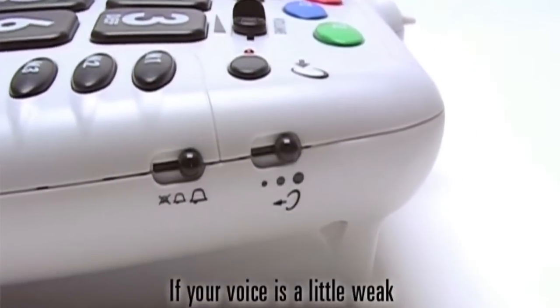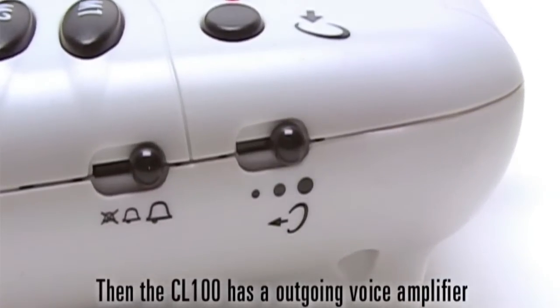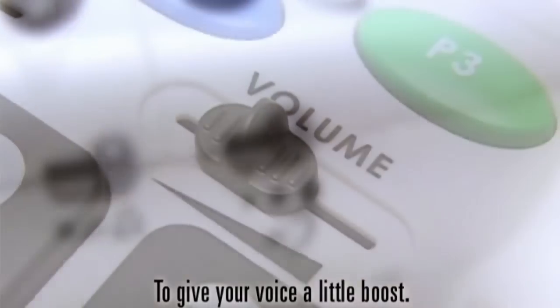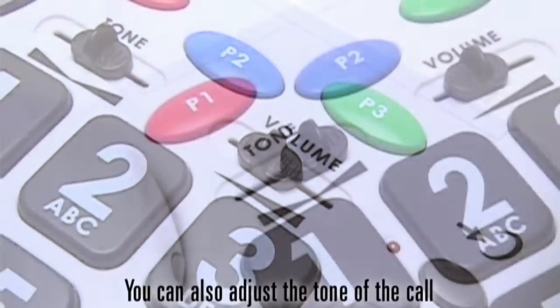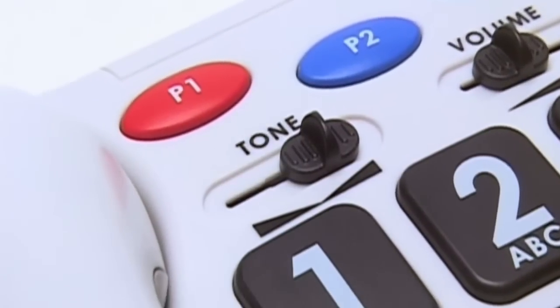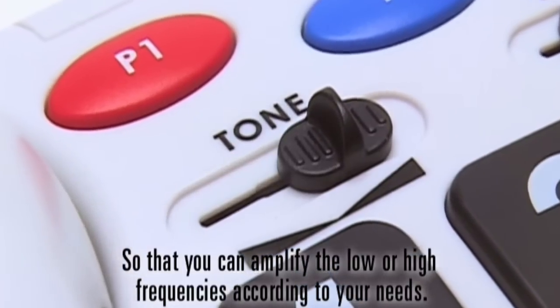If your voice is a little weak, the CL100 has an outgoing voice amplifier to give your voice a little boost. You can set the receiver volume level by moving the volume slider. You can also adjust the tone of the call to amplify the low or high frequencies according to your needs.